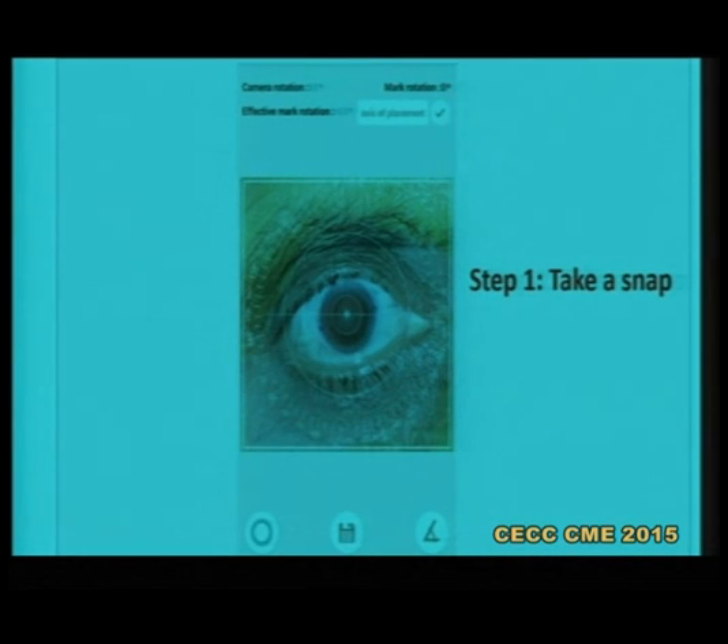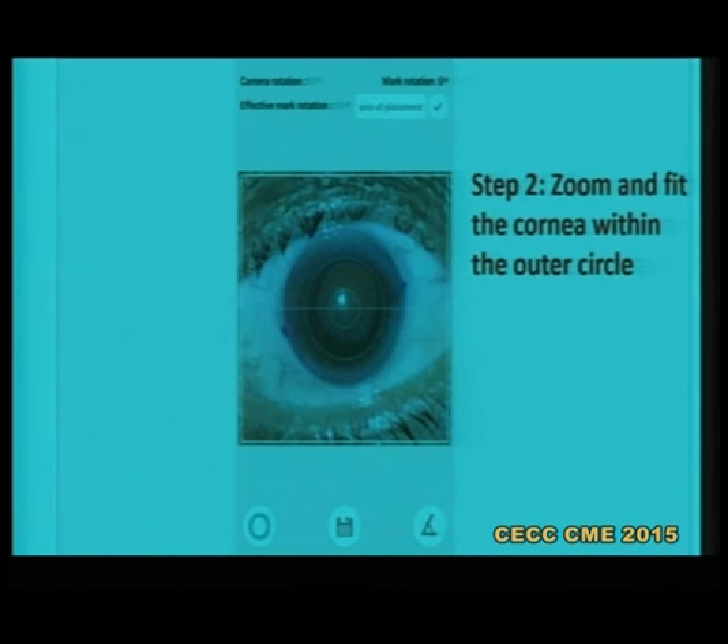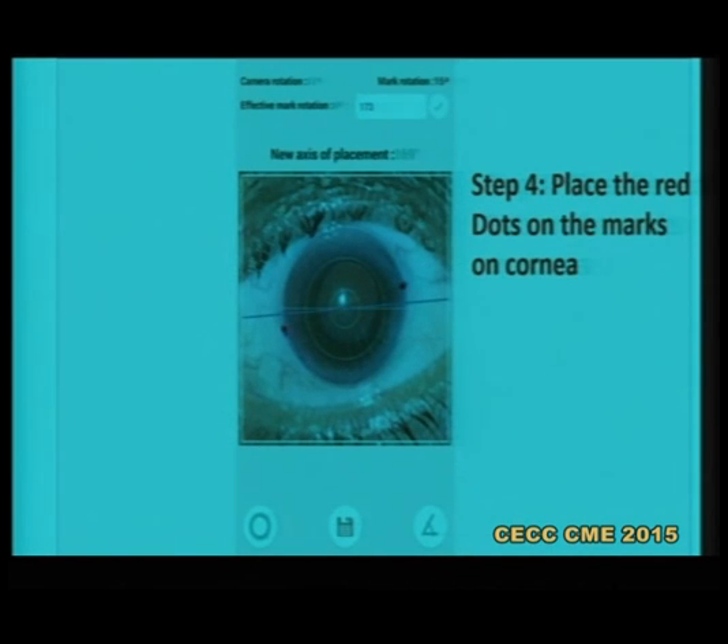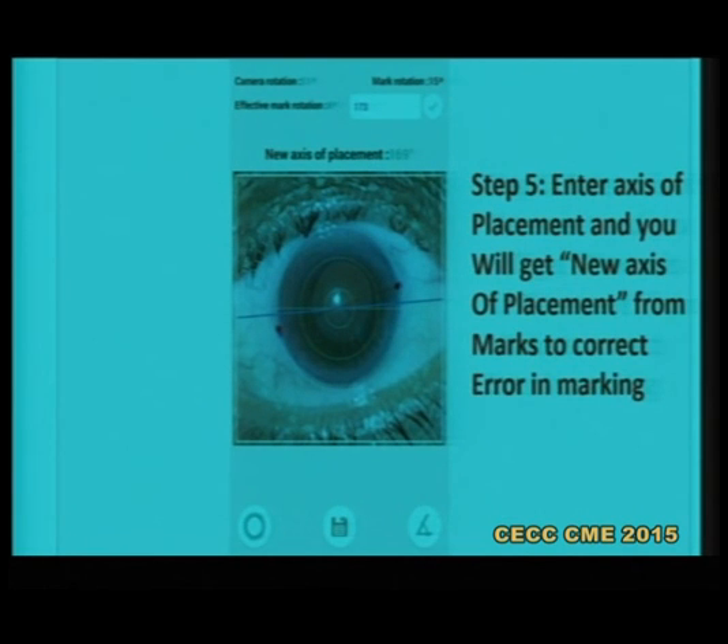These are the steps: first take a nice snap with the patient looking straight ahead. Once you do that, pinch zoom the cornea so that it fits the outer circle. Then press the protractor sign, align the red dots on the marks placed on the cornea. Enter the axis of placement where you want to place the IOL, and it will give you the corrected or new axis of placement — just like the eye trace machine gives.